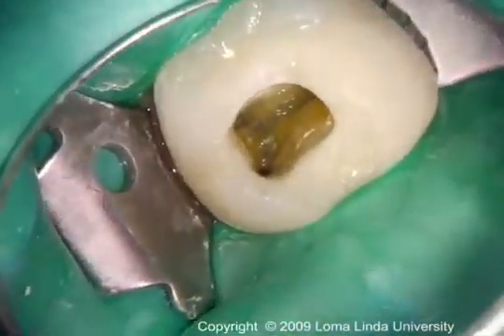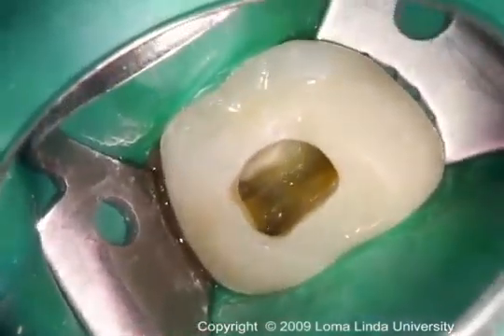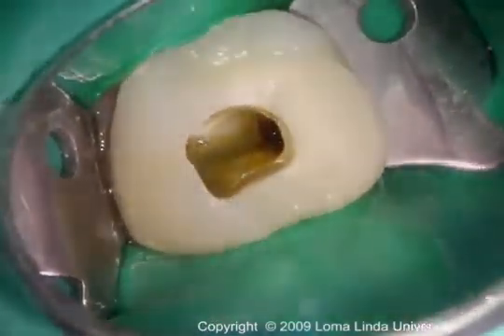After following the same protocol, a similar access outline is observed in a maxillary molar with full crown coverage.